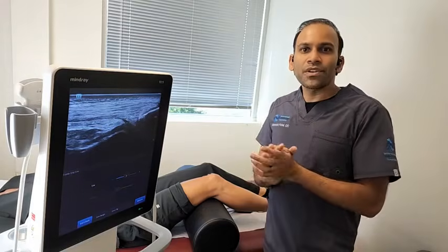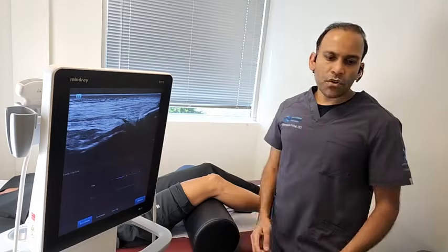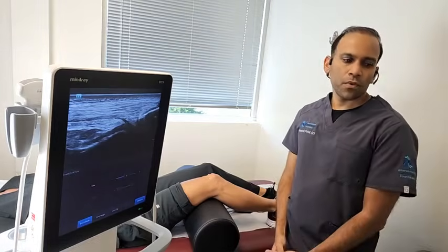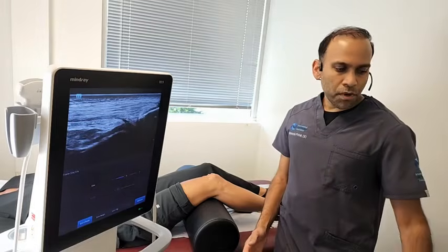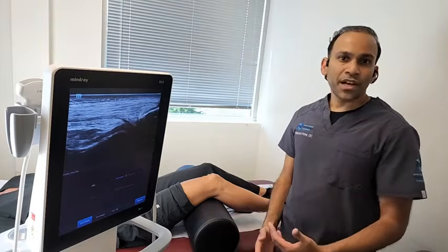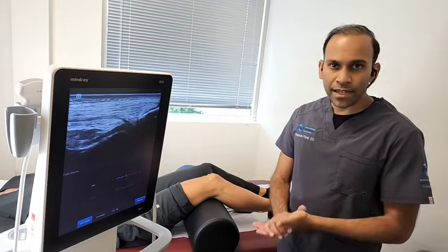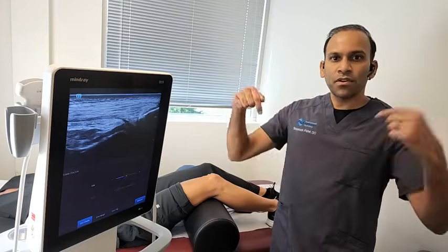Today we're going to be doing a live demo of a knee ultrasound. So the knee obviously is the joint where our thigh bone meets the lower leg bone. A lot of different injuries can occur with the knee, and a lot of different things can cause pain in one way, shape, or form. But the purpose of today is to demonstrate how I use ultrasound to evaluate the knee, more as an extension of my physical examination, to really determine all the things that may or may not be going on in the knee.